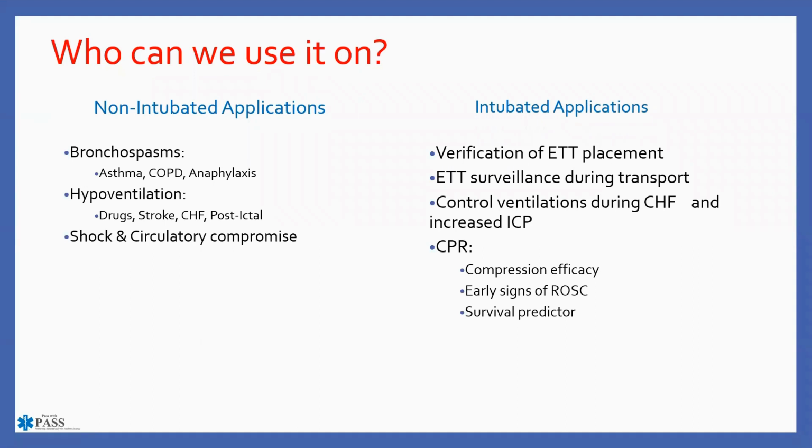In your intubated patients, verification of ET tube placement is paramount. That's probably the biggest thing, is verification that it is in. And then the second thing is make sure that your endotracheal tube has proper surveillance during transport. We don't want the patient to become extubated, and we did not recognize that. So if they're intubated, make sure that you're using it.